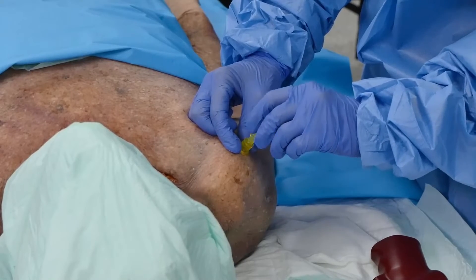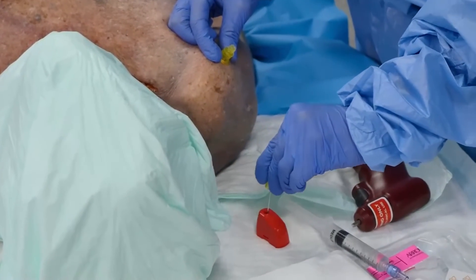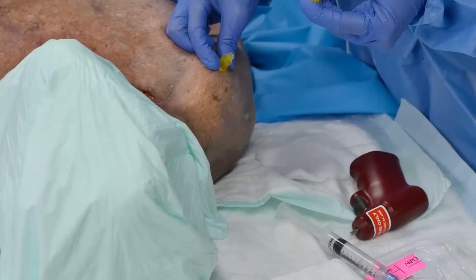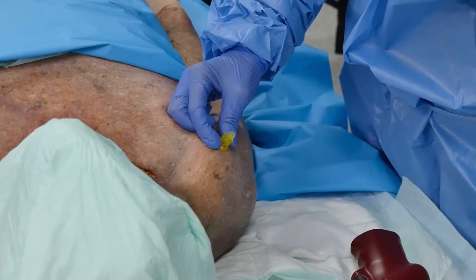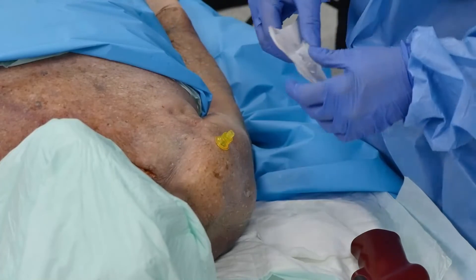I have my needle vise on a flat surface and I'm going to place the stylet straight in there, then discard it in a larger needle collector — that meets all standard sharp safety precautions.